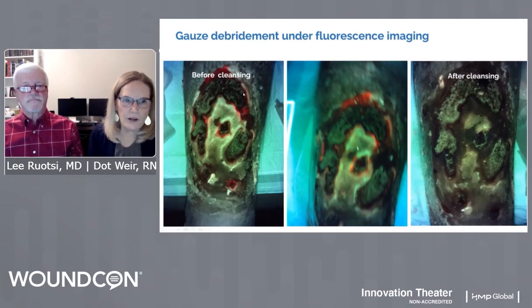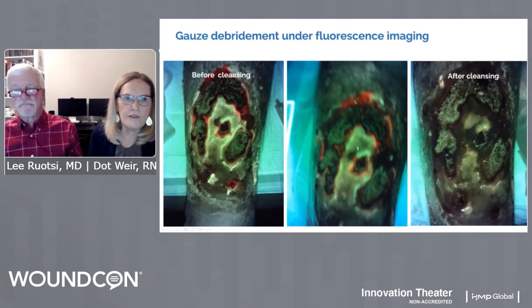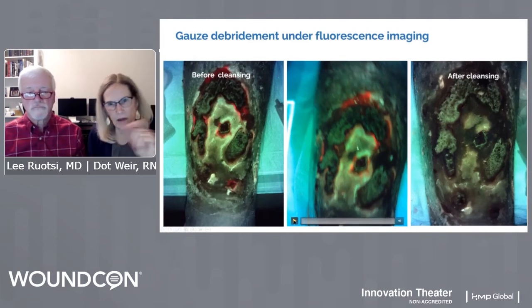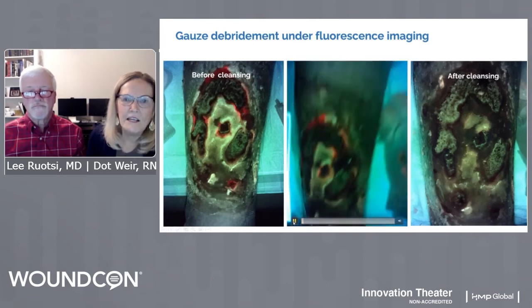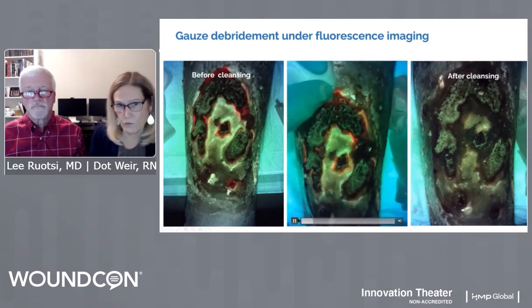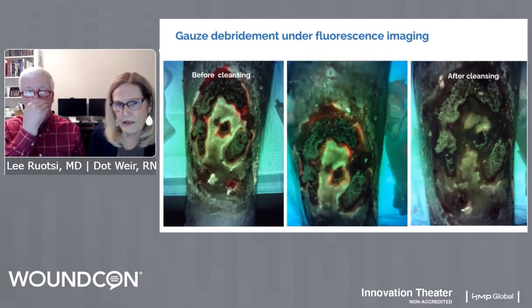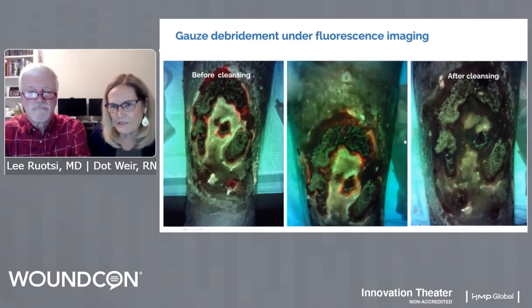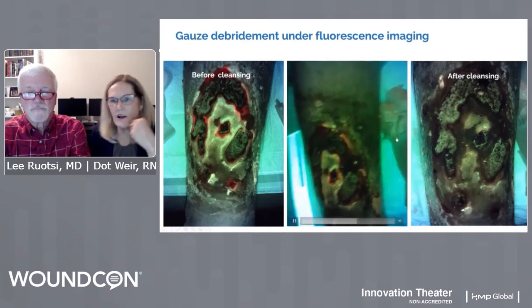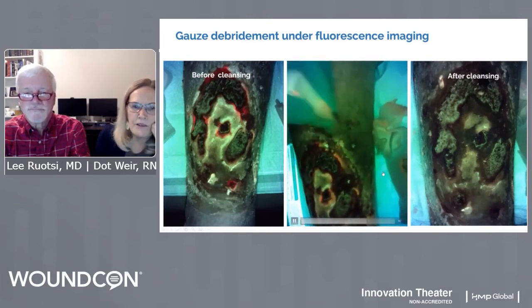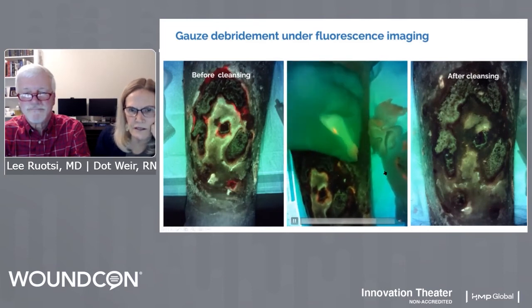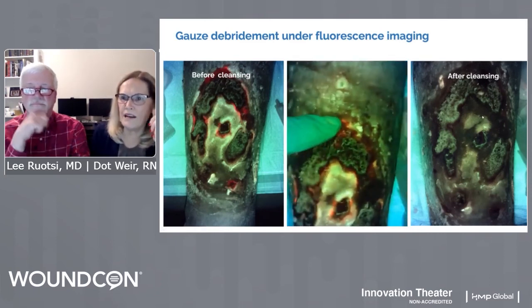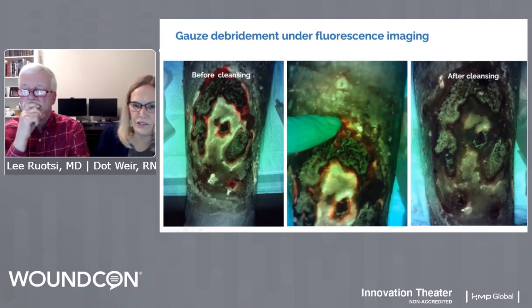The dark area is the wound bed itself, and the red fluorescence is showing up around it. This is a video — I'm holding the device while doing the cleansing. You can see I'm going right after that blush color, that red color, and picking it up with the gauze. If I get the device over a little bit, you'll see where I've moved my gauze — you can see the bacteria sitting on the gauze. This doesn't show the entire procedure because it took a few minutes, but on the right-hand picture, this is after that very same day after I finished doing the cleansing.